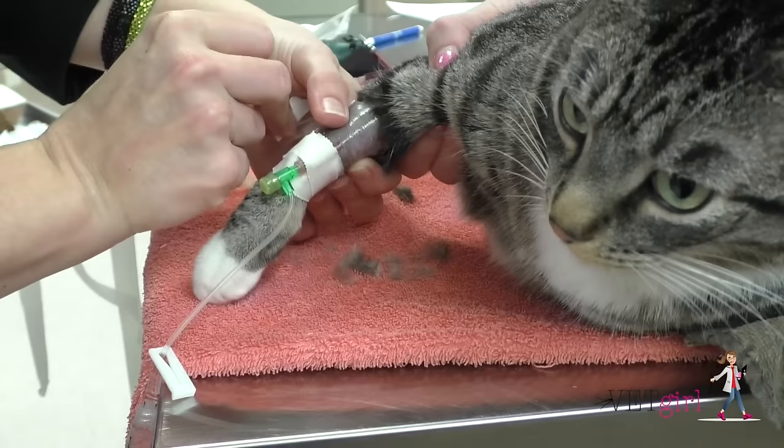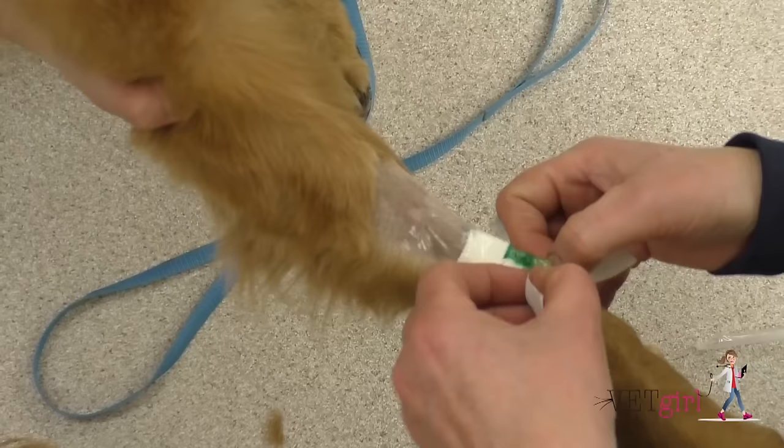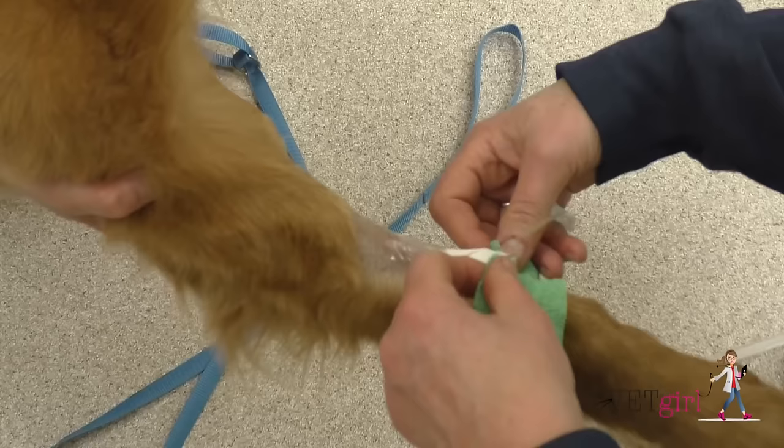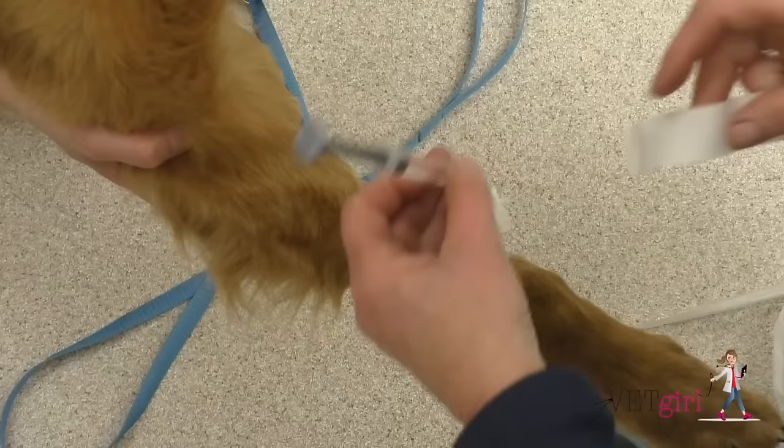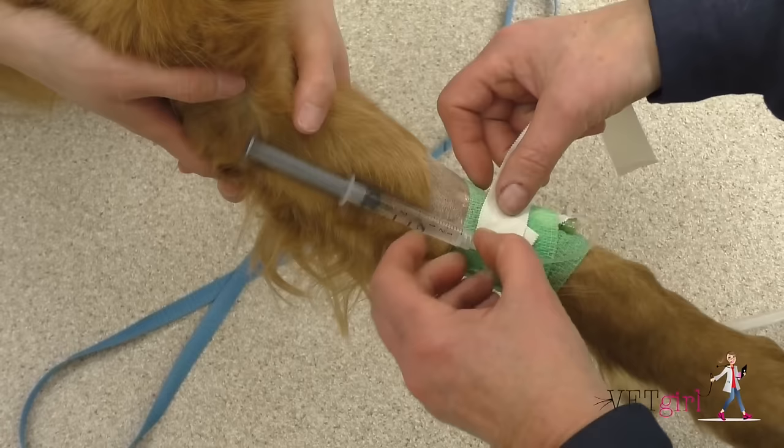A few hints. First, the restrainer can gently occlude the vein once blood fills the catheter hub to prevent further blood contamination during catheter placement. Secondly, place butterfly tabs on your white tape to help with re-wrapping of the IV catheter if necessary. Lastly, you can use a small cotton ball soaked in alcohol and touch it as needed to prevent the tape from sticking to your gloves.